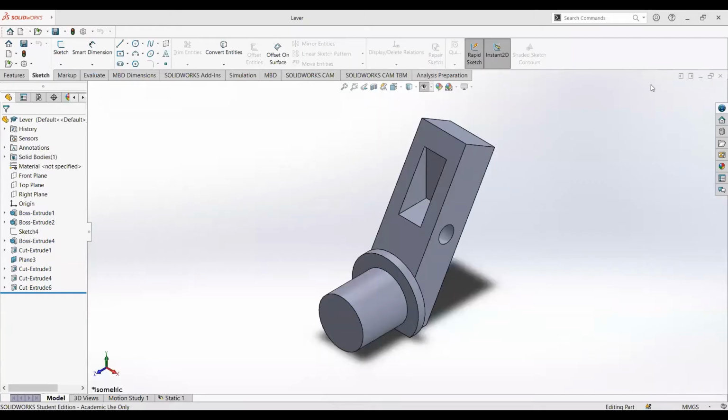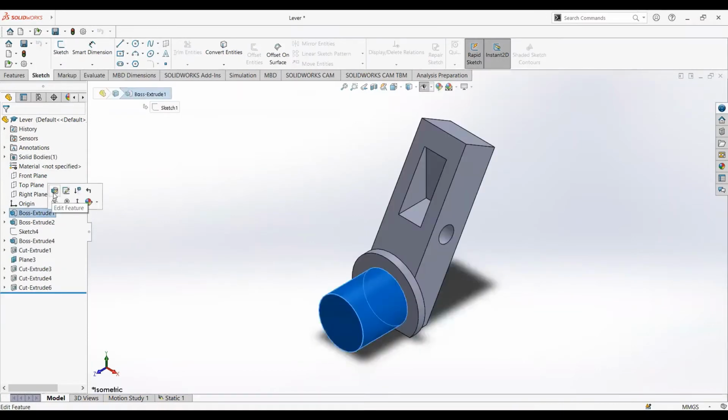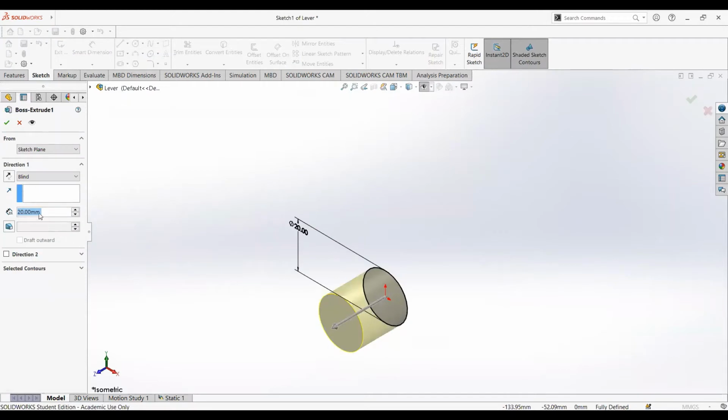Hello, I'm from JJing team, and today I'm going to show you how we created parts for our device called Laparoscopic needle driver. So this is the lever arm, or we called it a button bar. So first we sketched a circle right here. After that, we boss extruded that part by 20 millimeter.